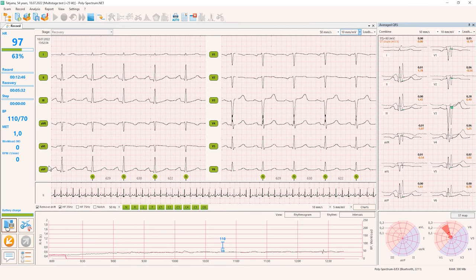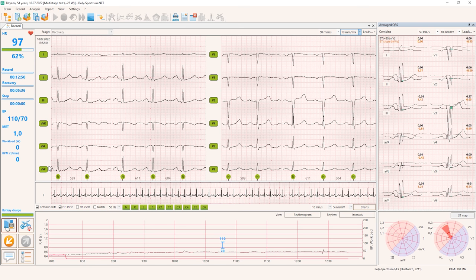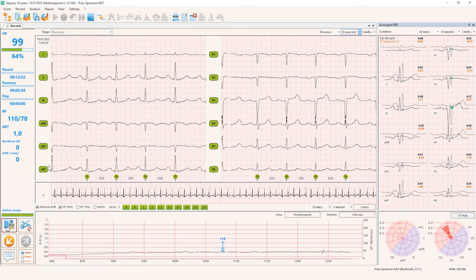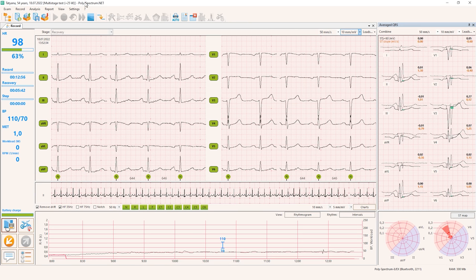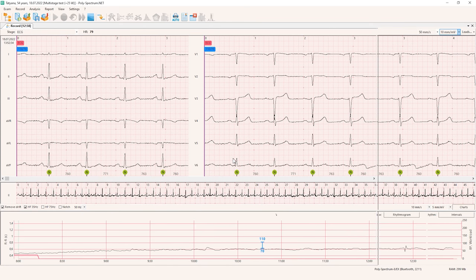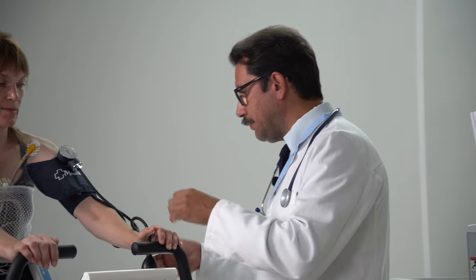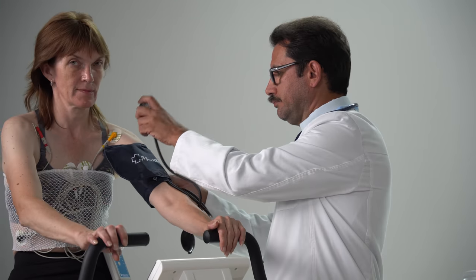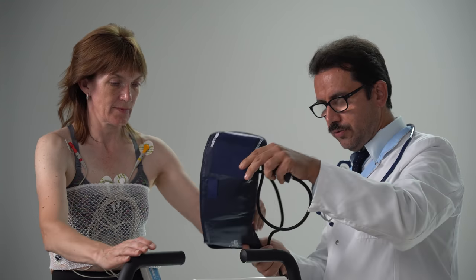So it's better to monitor ECG, record ECG, maybe 5-7 minutes after the test termination. If after this period you have nothing interesting, yes, we can stop the test, stop recording, and just free our patient from the bicycle and go to the analysis of the results.